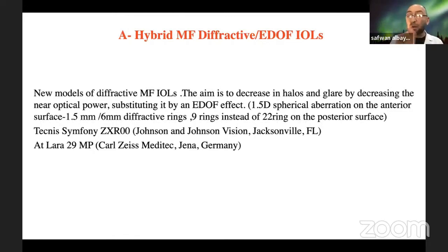So still now, even with those diffractive multifocals, we couldn't reach the power of the diffractive near vision, which means that till now, the highest diffractive EDOF can afford less than 2 diopter at the cornea level.